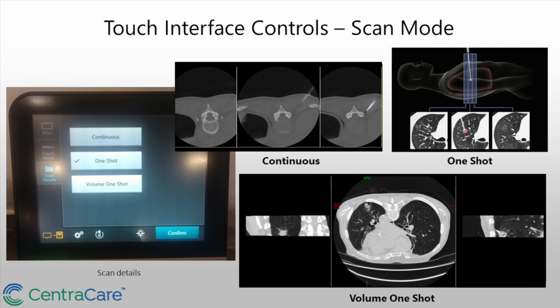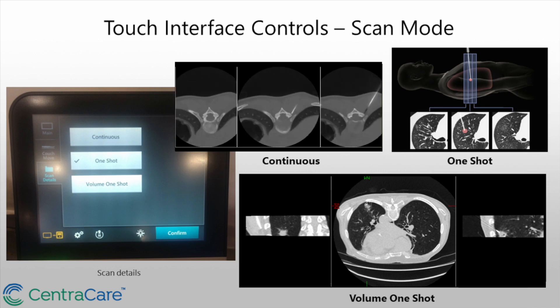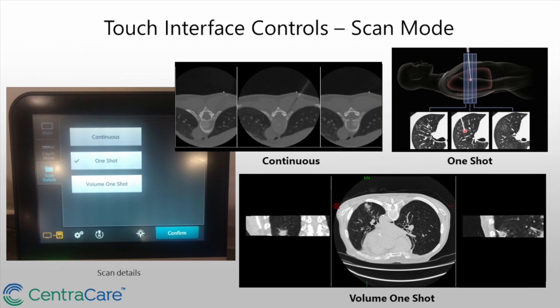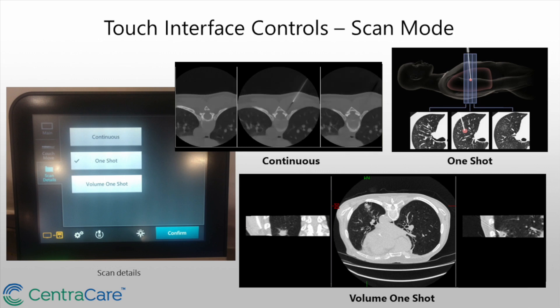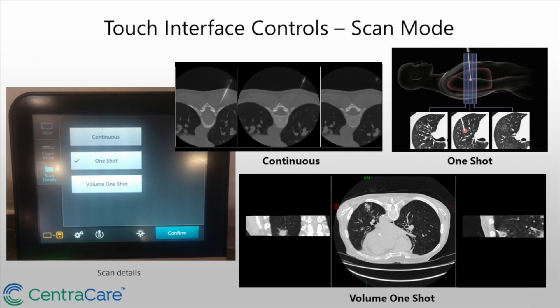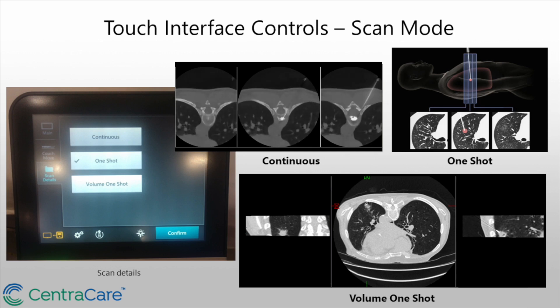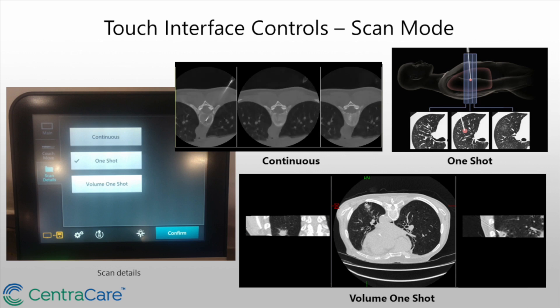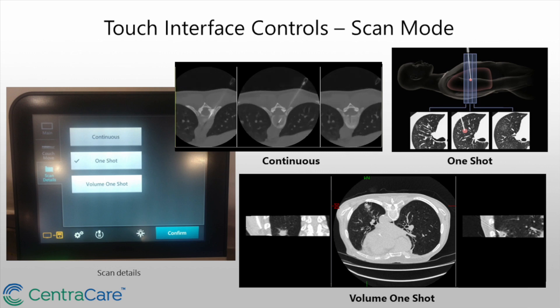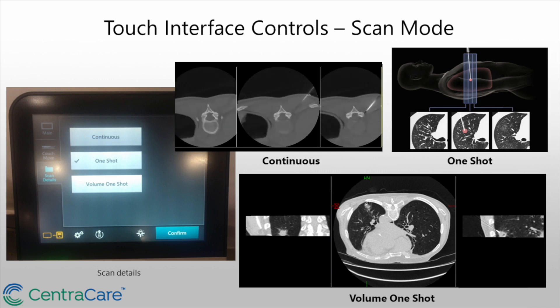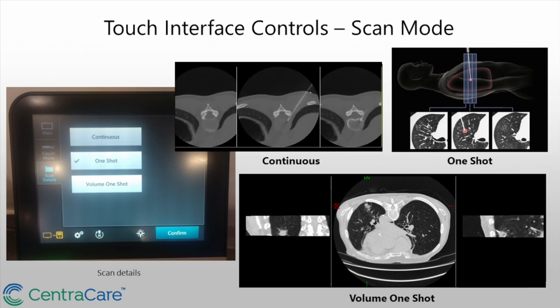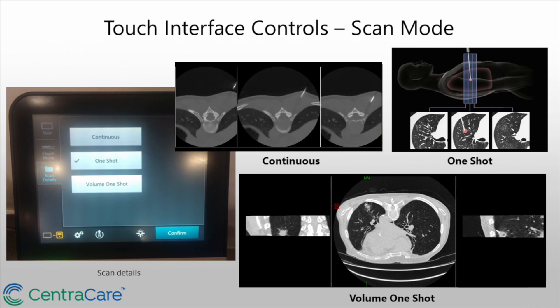This is the third category — Scan Details — which gives you the option to change the scan mode from regular continuous CT fluoro to a one-shot, which gives you an axial image, or a volume shot, which gives you orthogonal reconstructions — coronal and sagittal reconstructions. I have used this multiple times in spine biopsies and ablations, and it's a very useful tool.